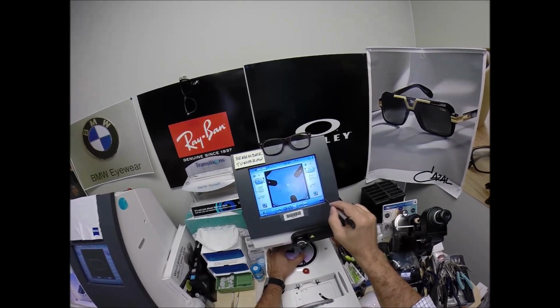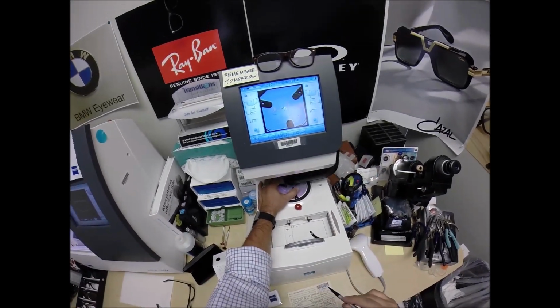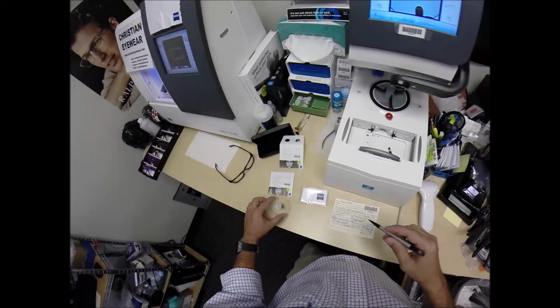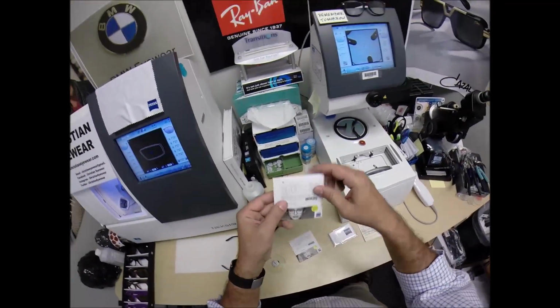As I study this, I hit that button. The arm's going to come down and place the block onto the right lens. We'll do the same thing now for the left lens. And in the future, I highlight.